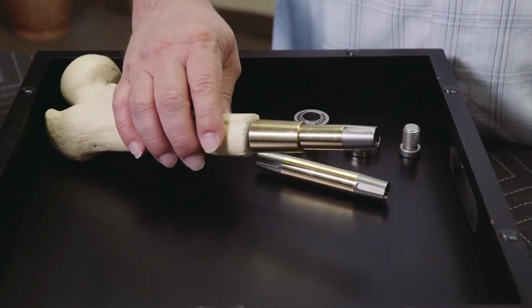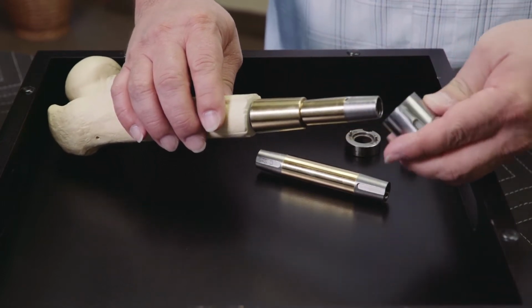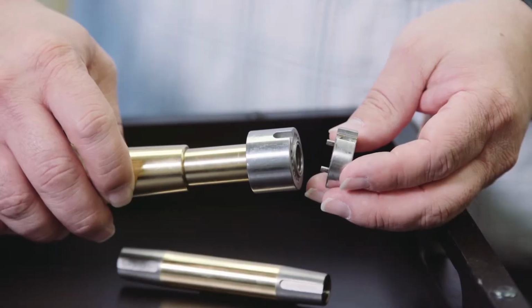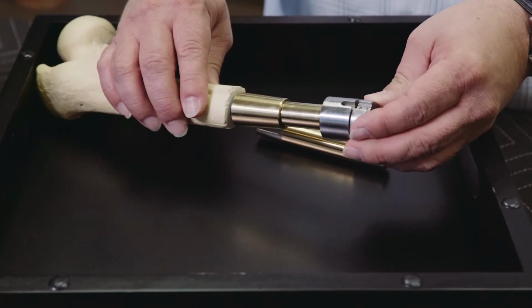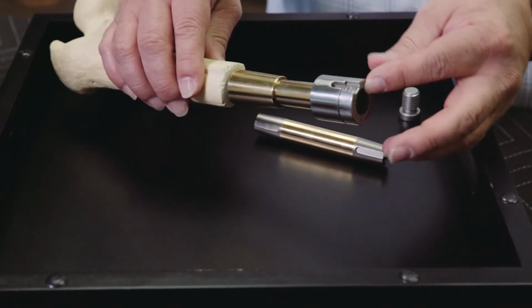Onto the end of the dual cone adapter slides a taper sleeve and an anti-rotation bushing. These are both held in place by another locking screw. The pins that are attached to the bushing insert into the taper sleeve. These pins act as a breakaway point to provide a failsafe in case the system experiences extreme torsional forces.